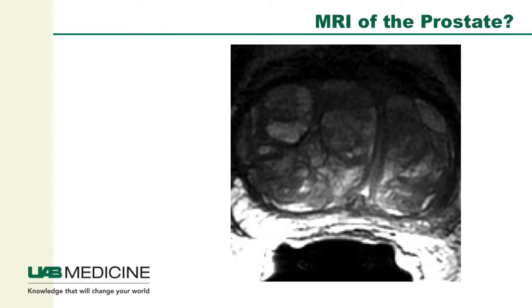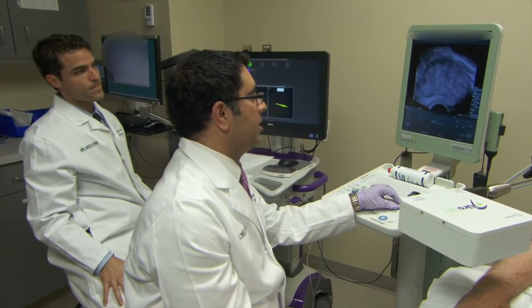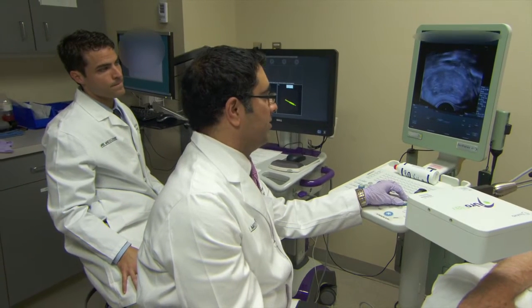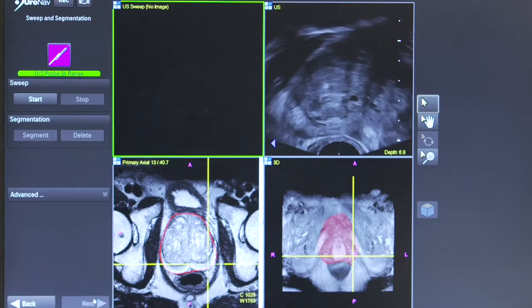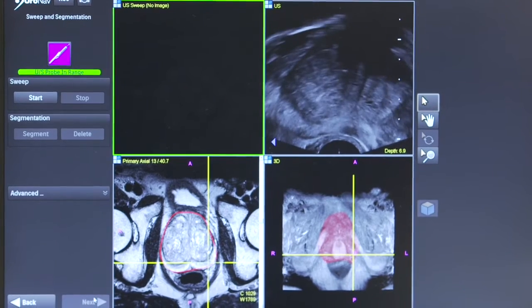So we ask ourselves, what role does MRI play in diagnosis and screening for prostate cancer? MRI classically gives a much better soft tissue resolution of findings within tissues like the prostate gland. It is able to accurately diagnose and find different areas of differences within the gland, deep in the pelvis, that are not examined accurately with a digital rectal exam or a nonspecific blood test like the serum PSA.